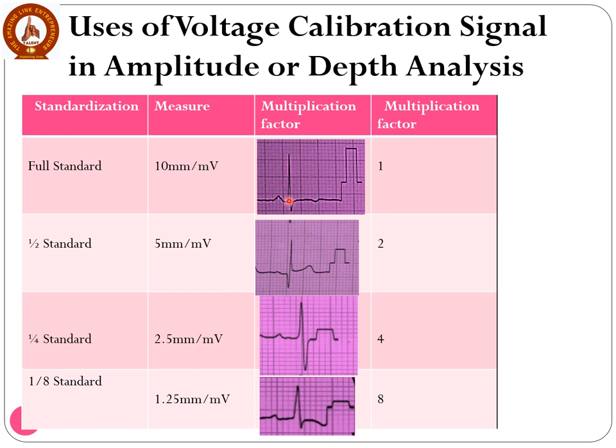For instance, for the amplitude of this R wave, we have 2 up here, 5, then plus 5, then plus 2 down. So that will give us 14. So 14 times 1 is 14. So you leave the amplitude that is measured. If it is the depth too, the depth of the S wave here, this is the S wave, not Q, so the depth here is 3 millimeter. The height here of the R wave is 14. So you leave it like that, in millimeter.